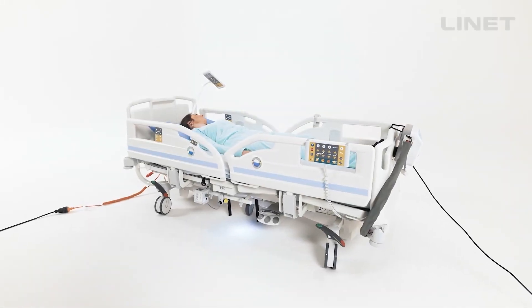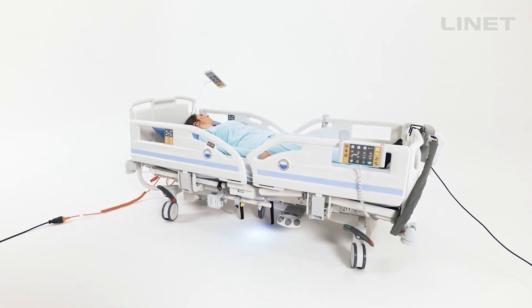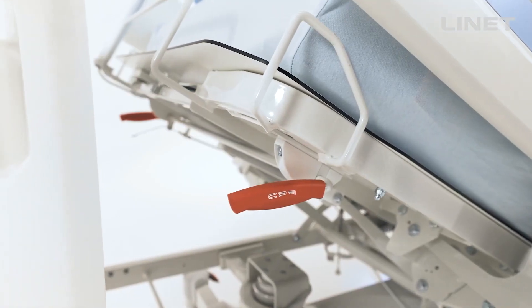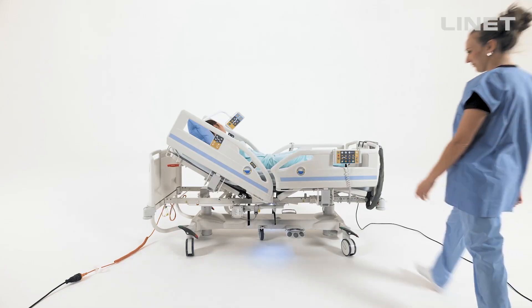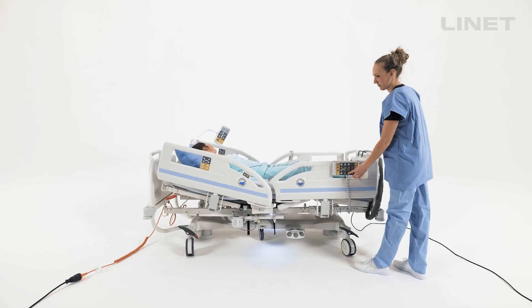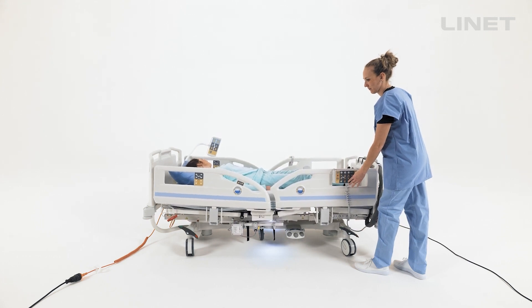LINET beds offer two ways to get the bed into CPR position: an electric CPR button and a manual handle. The electric CPR flattens the bed and lowers it to the lowest position so that chest compressions can be performed effectively.